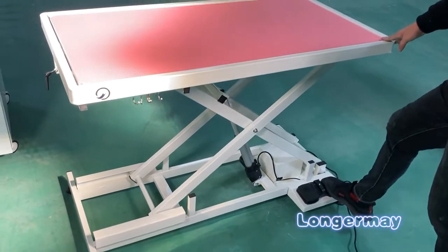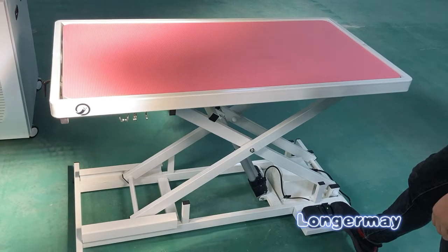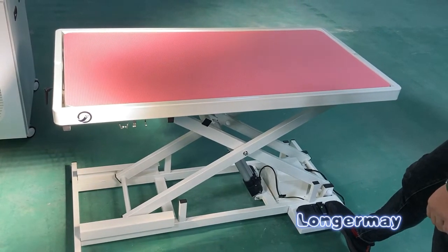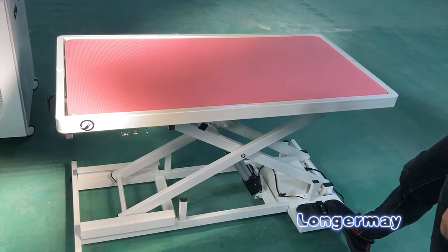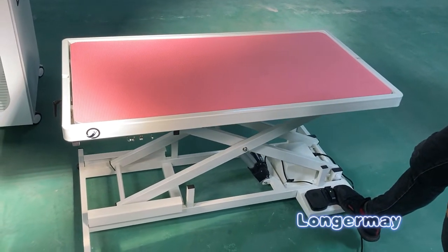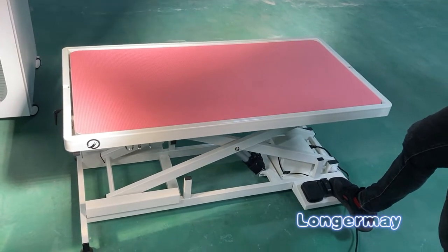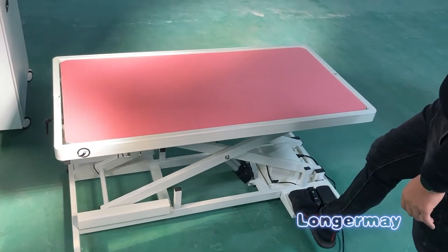Okay. This is the down function. And this is the up function.